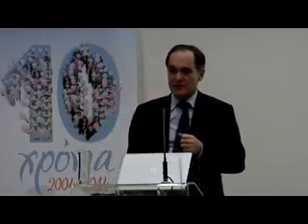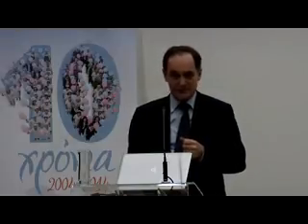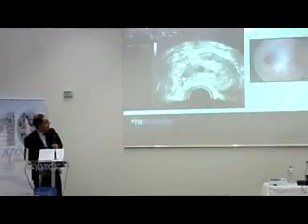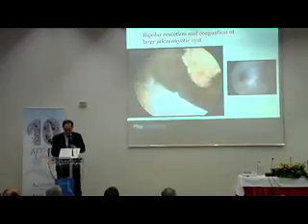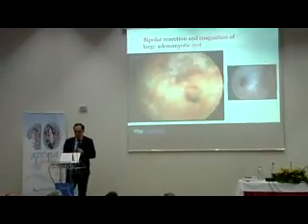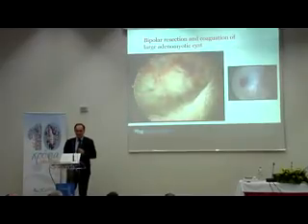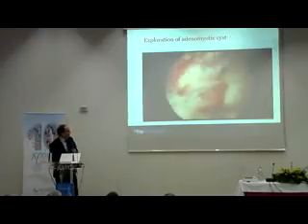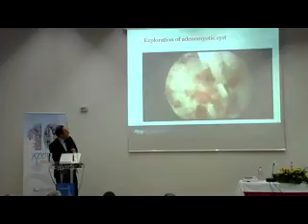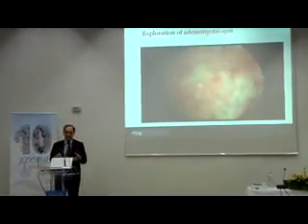And now, last but not least, adenomyosis. Who knows what adenomyosis is? Everybody? We have the womb here, we have a little hole here, and we see here the big cyst. Adenomyosis is one of the main research topics of Professor Grigoris Grimbizis, and I'm sure he will also make a new classification here. If you go into this lesion, you see it is just like an ovarian endometrioma.